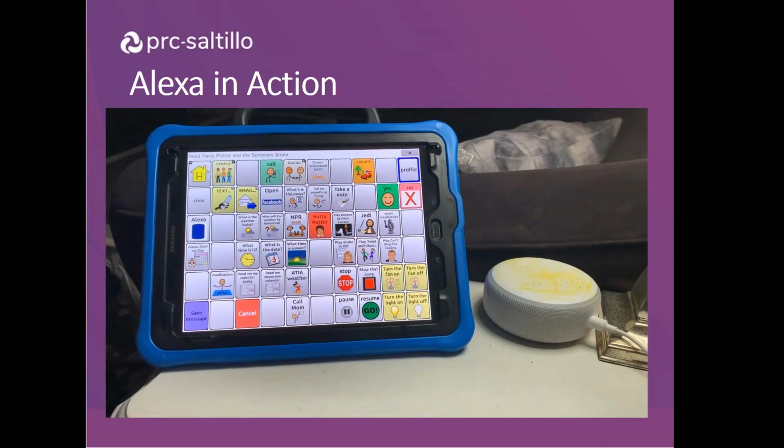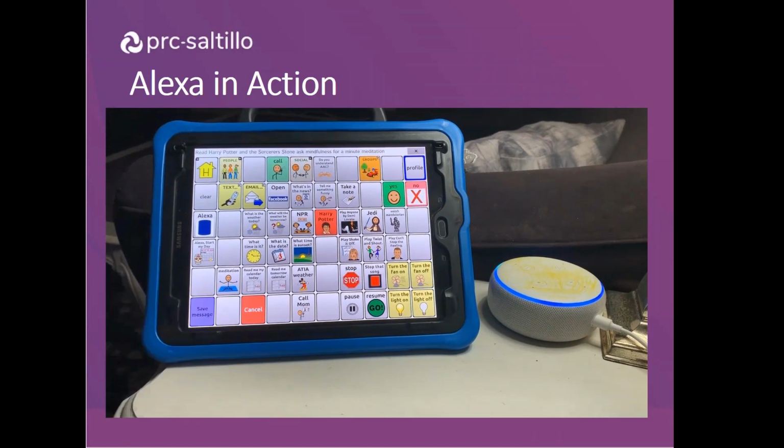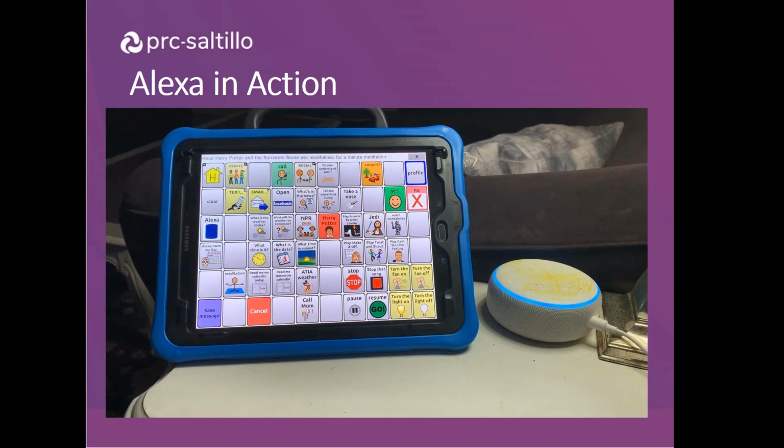Alexa, ask mindfulness for a minute meditation.